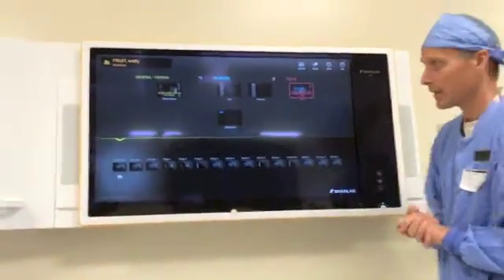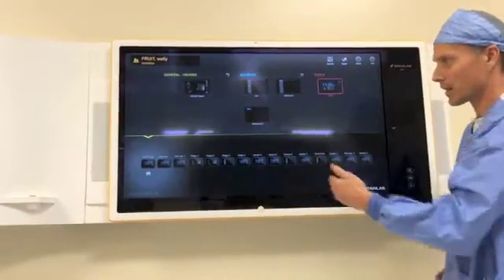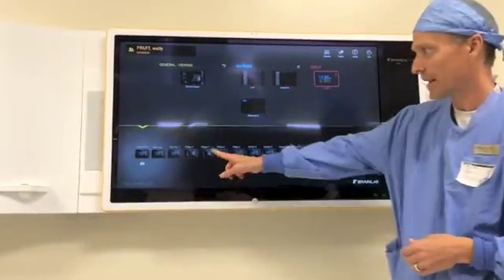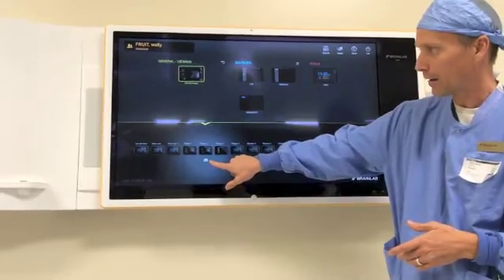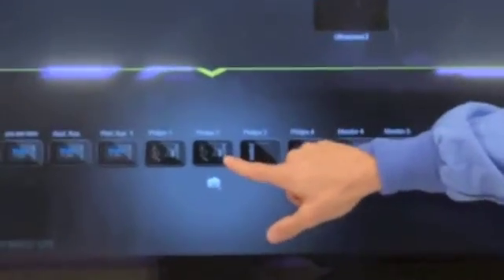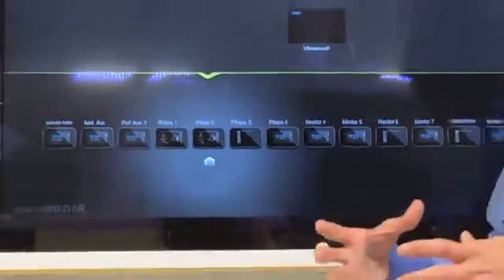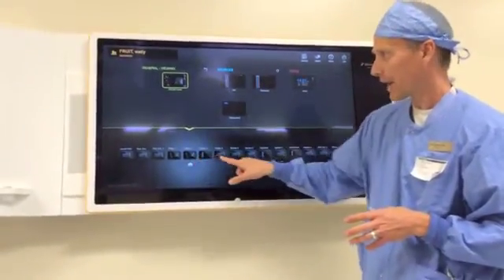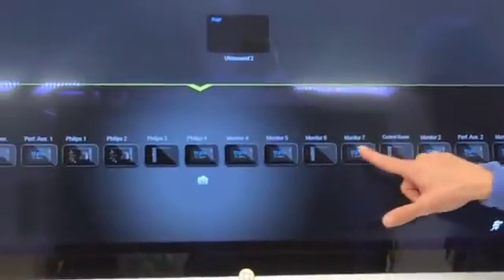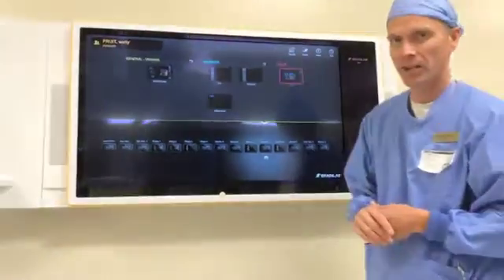The last thing I want to point out with this Buzz system is screenshots. There's a camera icon under the monitor that we're on. If the doctor requests a screenshot of what's happening on, say, the Philips 2 monitor, all you have to do is select the monitor in question — you'll see this arrow drops down in addition to the camera. Once you press the camera, the software takes a snapshot. I'll do it again so you can see that little flash. The software has created this snapshot, which is a JPEG image, that we have the ability to export to an external media device.